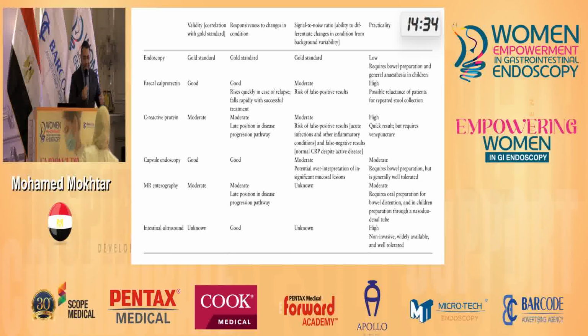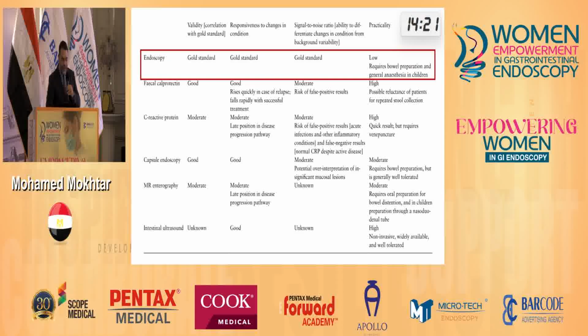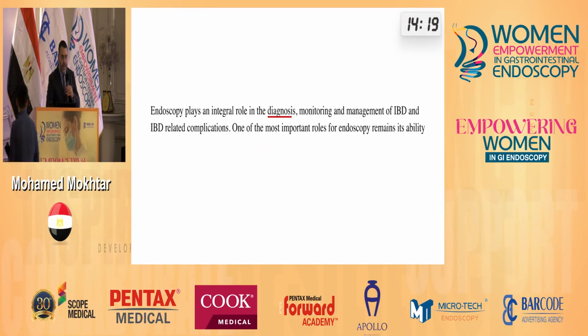Despite the advances in biochemical markers, biomarkers, and radiological investigation, for IBD patients endoscopy and colonoscopy remain the gold standard. It's not just a matter of diagnosis. It's diagnosis, monitoring, and the management plan of IBD. It's related to the endoscopy.